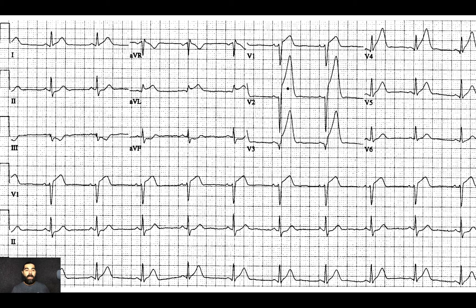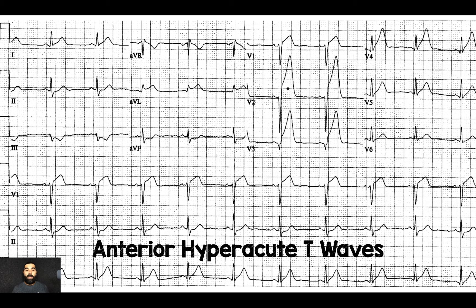This is the EKG you get. You can see there are ST elevations in I and AVL, and reciprocal depressions in the inferior leads II, III, and AVF. But what really jumps out at me is V2 through V4 — those T waves are not normal. Those are hyperacute T waves, and they can sometimes be the first sign of acute ischemia in a patient having an occlusion myocardial infarction. Here you can see the anterior hyperacute T waves.